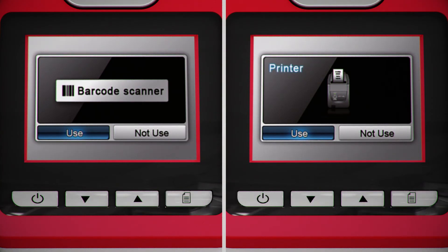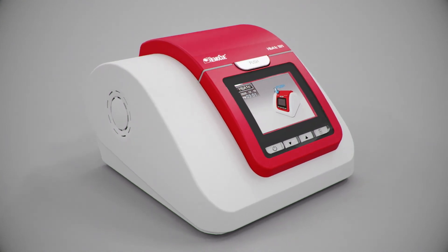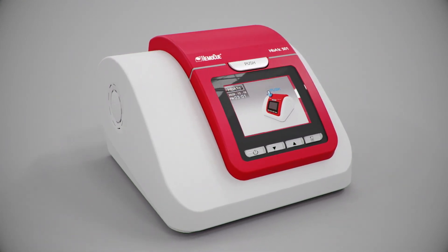If applicable, select barcode and printer in the same way using the mode button and arrow keys. Your analyzer is now set up and ready for use.